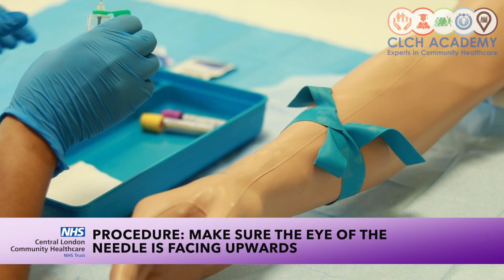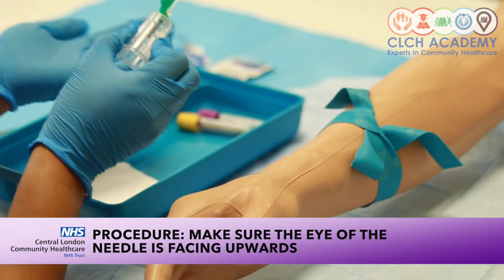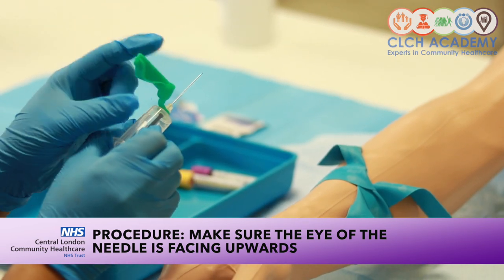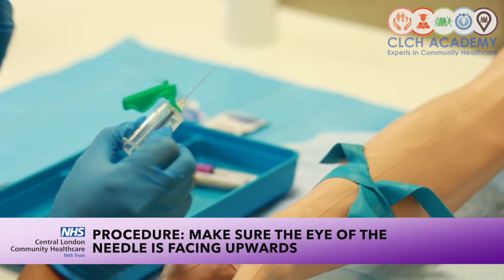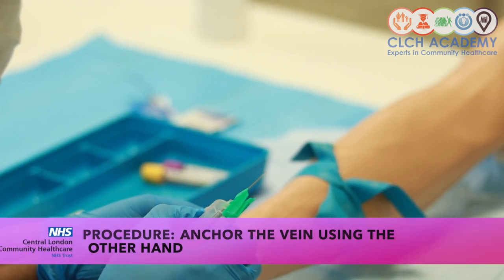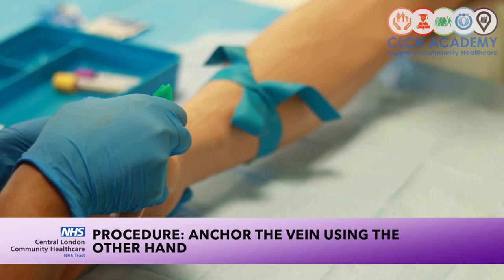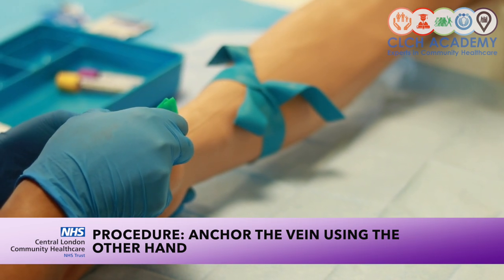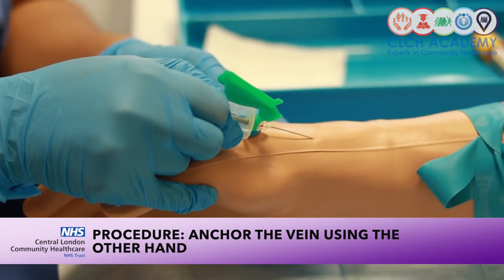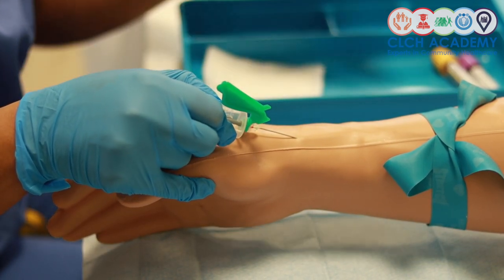Once again, I like for the eye of the needle to be facing upwards. That means the cap is not to the side or underneath, as that will occlude my access to the vein. So I make sure that the eye of the needle is facing towards me, and the cap is directly above that. Right, again, I'm going to give myself a little bit of traction here into the vein until I get my flashback. Now I have my flashback. Okay, flashback is got, keeping my wrist very steady.